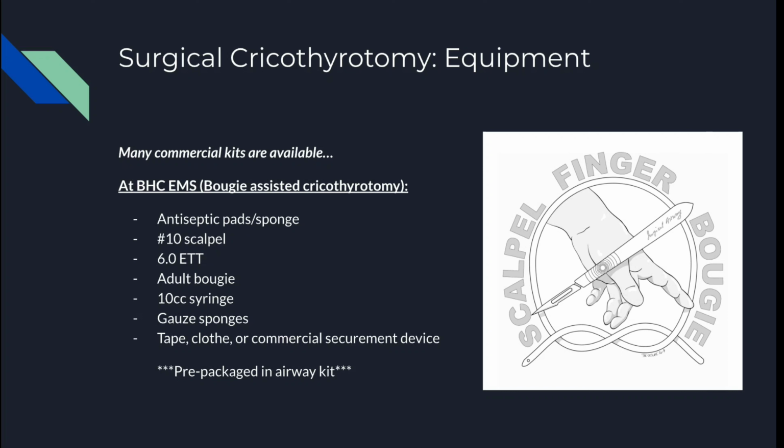Once again, these are prepackaged. They are in all of our airway kits, pretty clearly labeled and available should you ever need one.